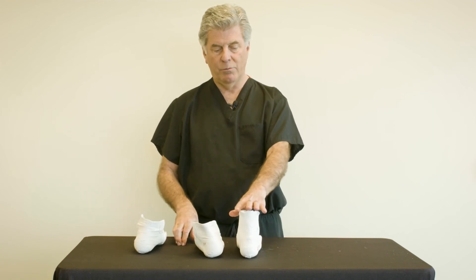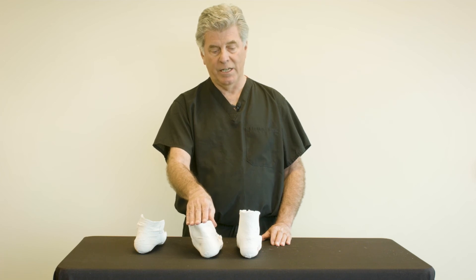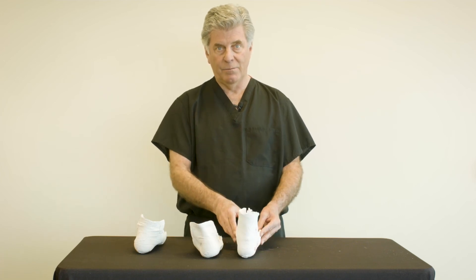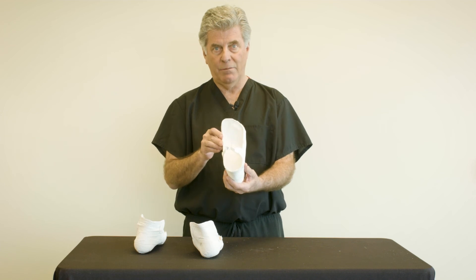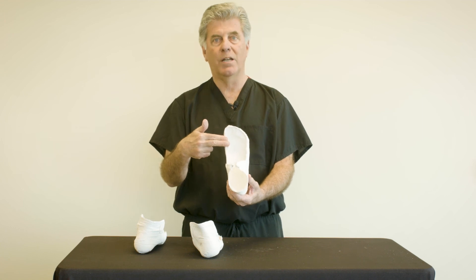This brace will end up controlling the patient well. It'll be more comfortable than the poorly cast brace, which has a very low likelihood of controlling deformity and may have many problems that need to be adjusted later. So let's anticipate ahead of time with our casting process by simply pushing down on the first ray and reducing forefoot supinatus.